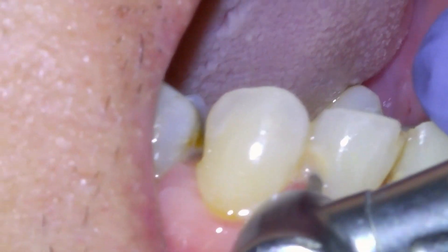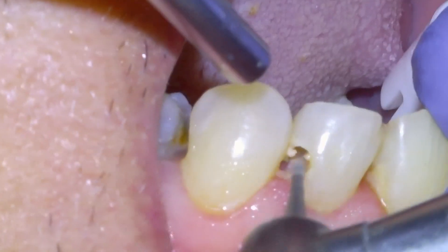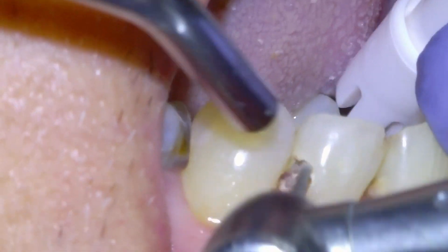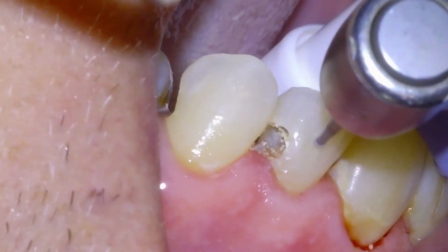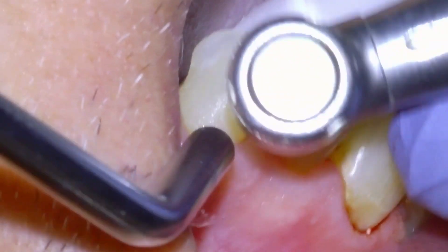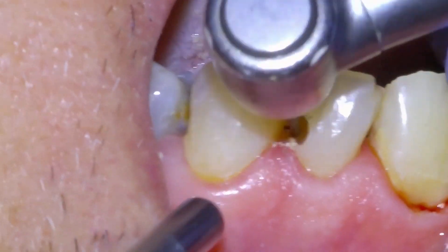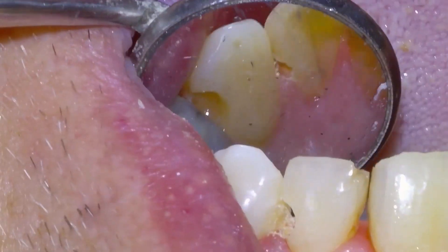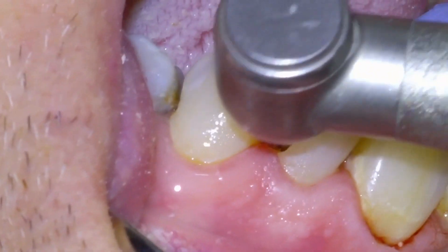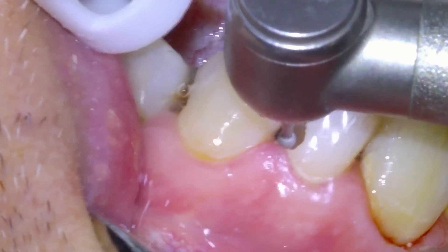Basically what we're going to do is remove that tooth decay and replace it with a bonded dental restoration, or filling. Once we have accessed the tooth decay we're going to remove it with this slow speed carbide burr. Tooth decay is essentially a bacterial infection of a tooth that causes it to go soft, and so it peels away quite easily when we instrument it with this slow speed carbide burr.